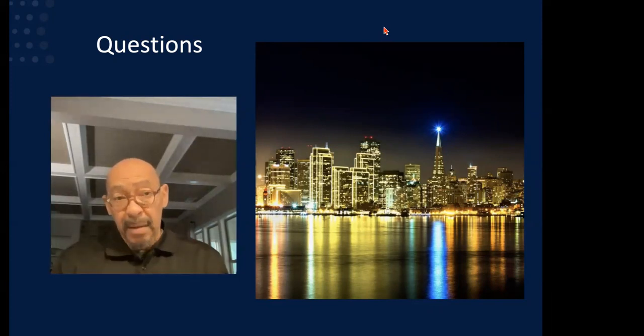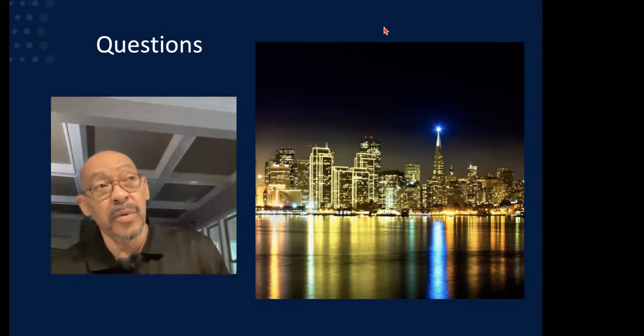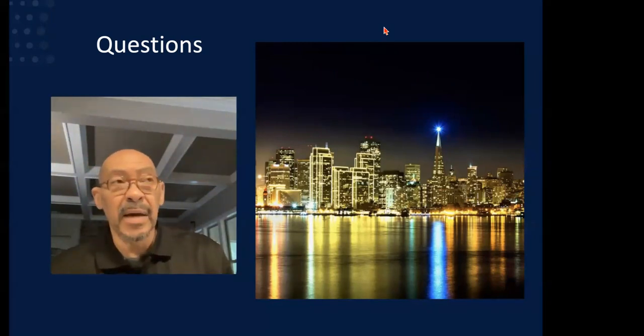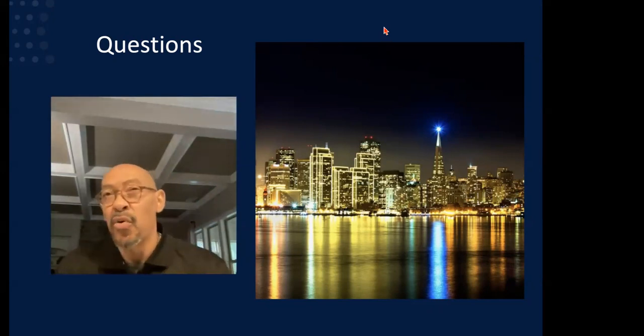So how much accommodative amplitude can that patient get? The standard that we are putting in the eye is 3.25 diopters of accommodative amplitude. We haven't gone higher. This lens was actually designed to be a 14 diopter accommodative lens. The reason we pulled it back is we don't know how the body will react or the eye will react to 14 diopters. And so it was an ethical reason why we ended up with 3.25 versus a design issue. We designed it for 14, but we cut it back to deliver 3.25.